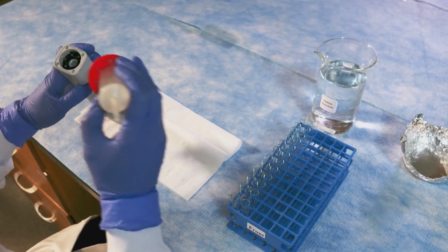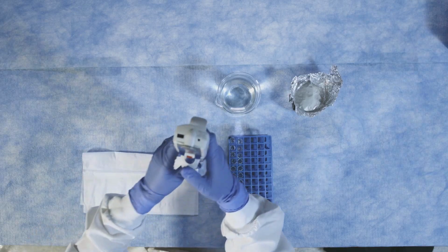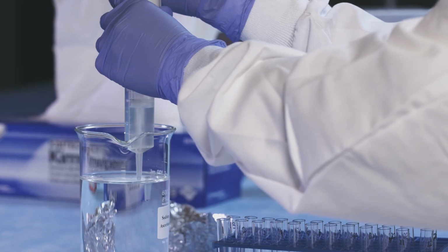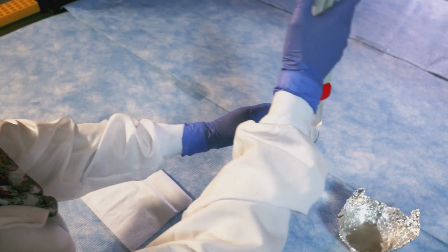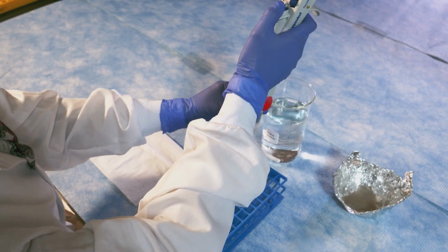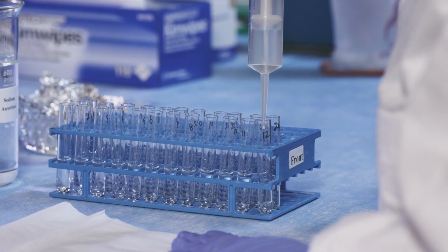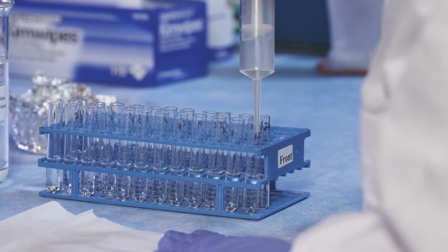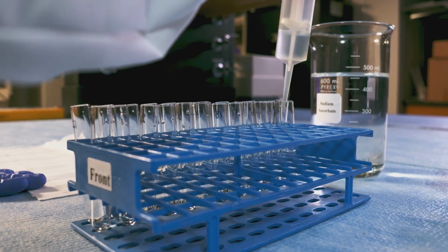Use an automated repeater pipette with a 25 milliliter tip to add sodium ascorbate solution to the glass tubes. For a roughly 1 to 100 dilution of serum samples, use 1,475 microliters of sodium ascorbate. For a roughly 1 to 140 dilution of whole blood lysate samples, use 2,075 microliters of sodium ascorbate.